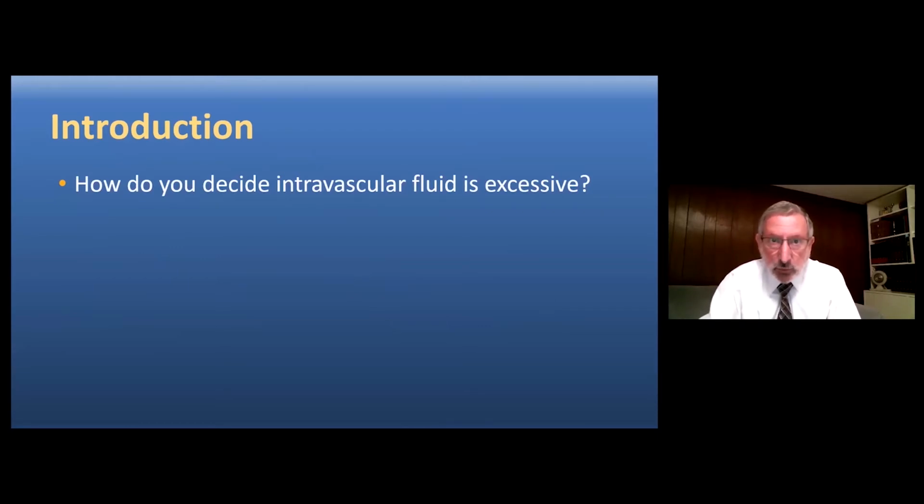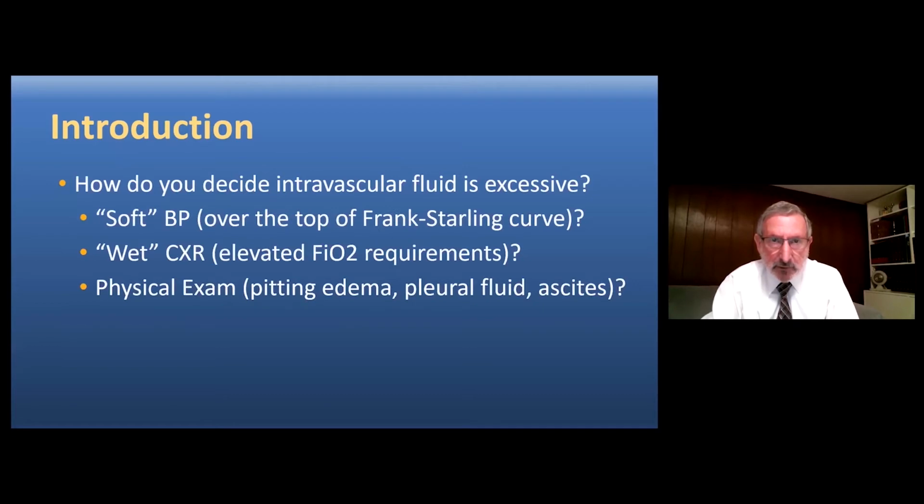And that will take clinical judgment and opportunities to add certain variables together with the SVI. But SVI, cardiac index, stroke volume, and systemic vascular resistance, as Kathy's explained, will go a great way in helping you discern the patient's physiologic state.